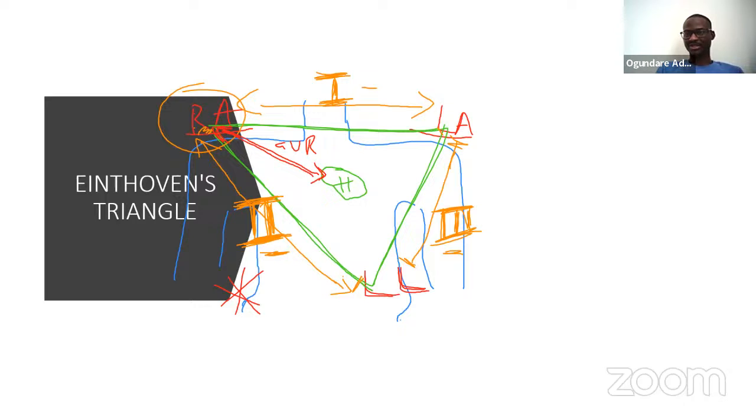Okay. When you see R, you know it's right. So we have a close relationship with the right arm. So AVR, right arm. So the potential difference for lead 1, 2, 3 is just the relationship between the electrodes themselves, like from the right arm to the left hand, then from the left arm to the left leg. But now their relationship with the heart itself is what gives the augmented leads. So from the right arm to the heart is what shows as AVR.